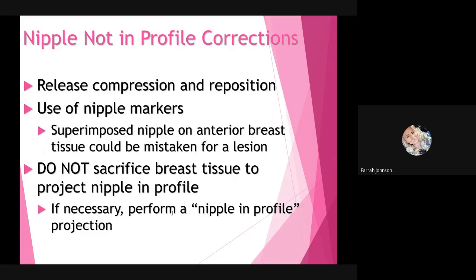So if the nipple is not in profile, here are some corrections you can make. You can release the compression device and reposition. You also want to use nipple markers. The use of nipple markers is going to tell the doctor where the nipple is on every projection. Where I worked, this was a requirement for every patient, but that may change depending on your facility. Now, the superimposed nipple on anterior breast tissue could be mistaken for a lesion, which is why we use those nipple markers.